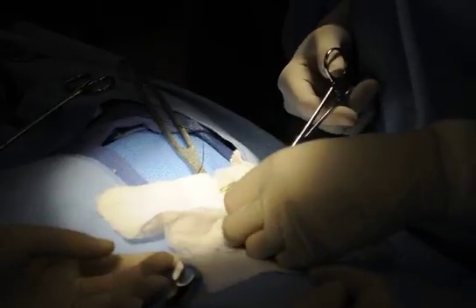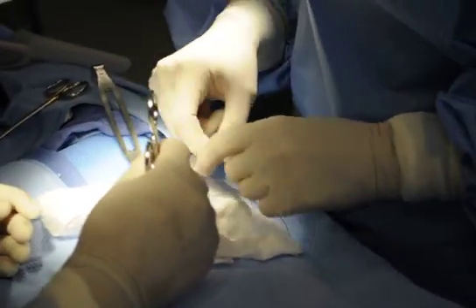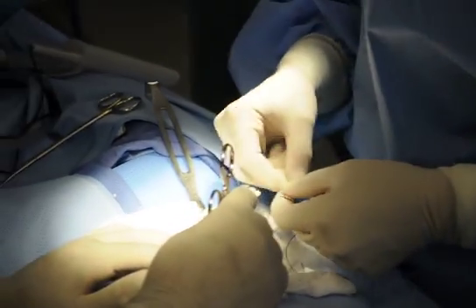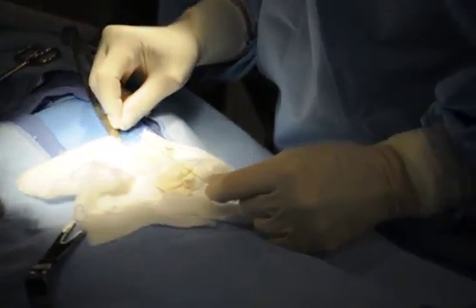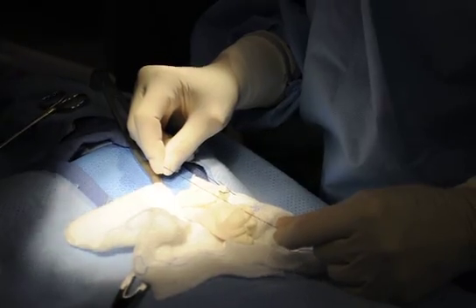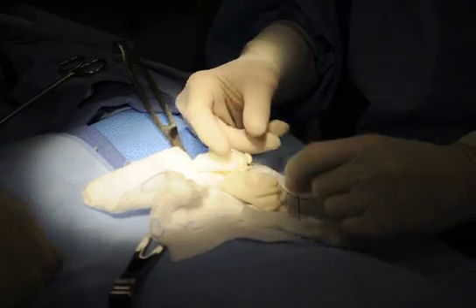So now what we're going to do is push this down into there — push lightly. When I say take it off, you've got to push down just slightly. Don't push all the way through the other side. Now take it off. Is the tip of that dirty? Yes. So don't be touching it. Then you put it in there. See, now the stump is gone.